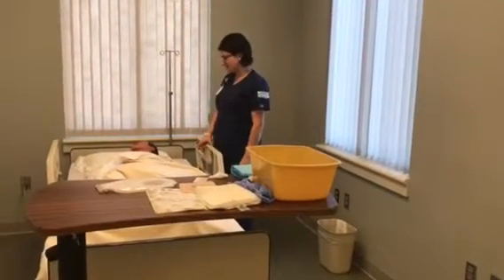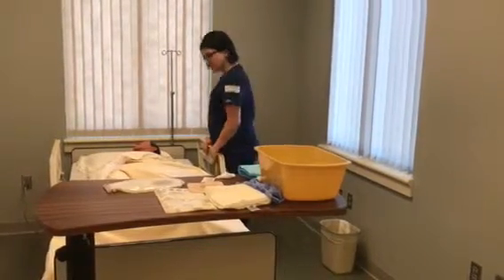I checked your orders, and we just need to change your ostomy bag. Can I get your name and date of birth, please?